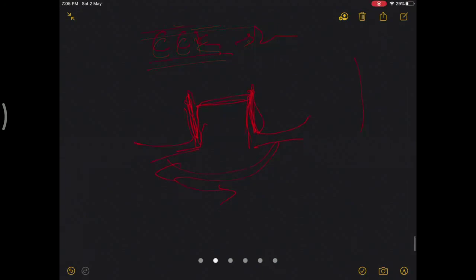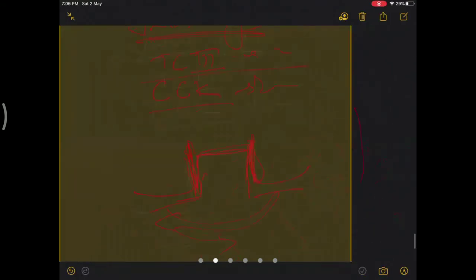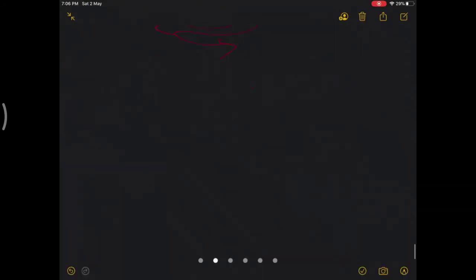Okay, so moving on, we have more constrained models called hinge total knees. There are two varieties. One is with a fixed hinge, which is almost obsolete because it will not allow the rotatory motion which happens in a normal knee. It is not a simple hinge, as I explained yesterday. So we have a rotating hinge.